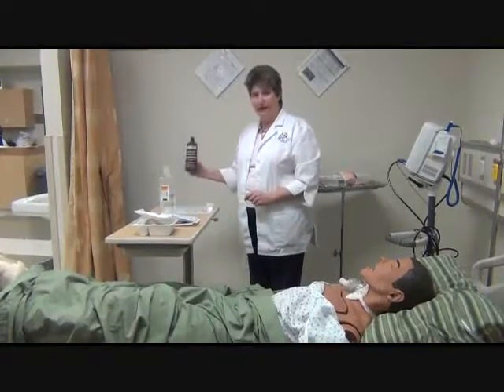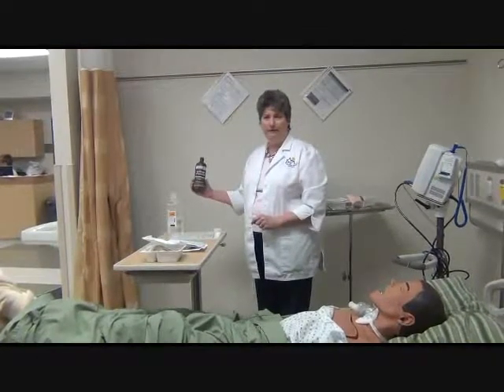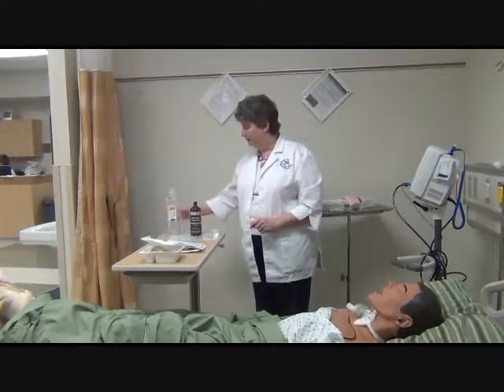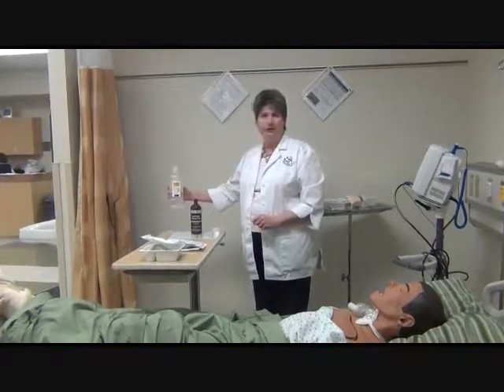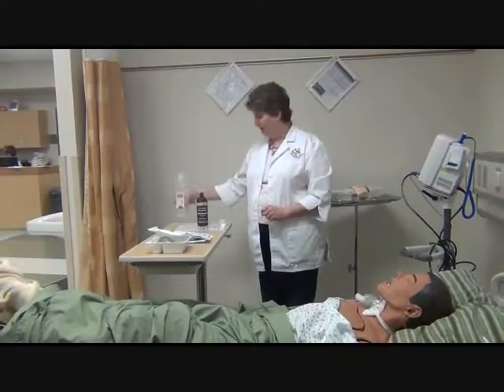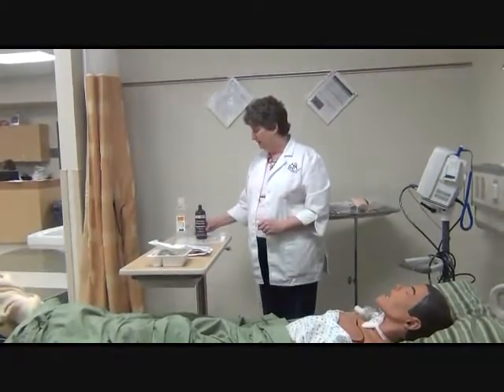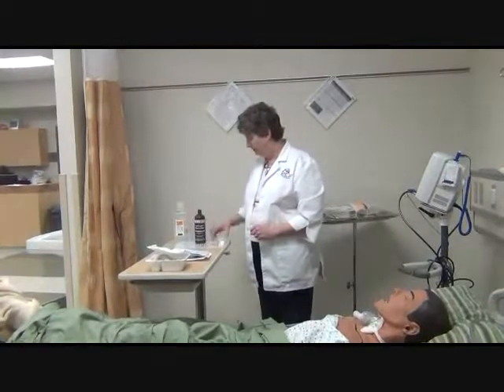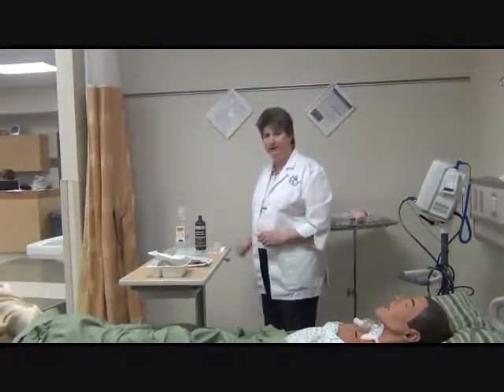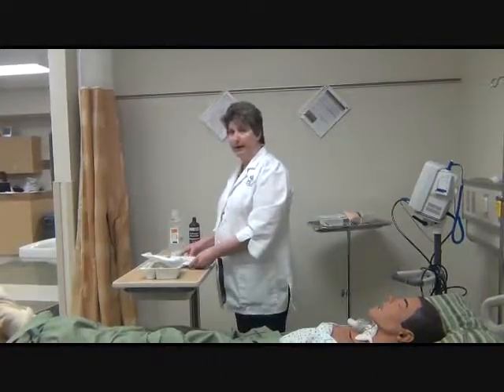You're going to use a half and half hydrogen peroxide, and also then you want your normal saline as your suction irrigation, and then also as your cleaning water for your trach care. So we're going to use these several times. Make sure your caps are set down on the table, so again, you're not contaminating the inside of your cap.